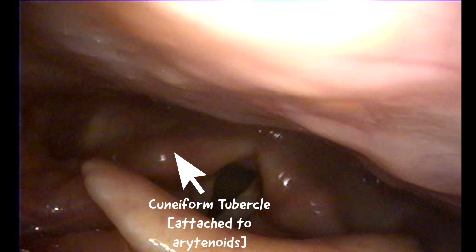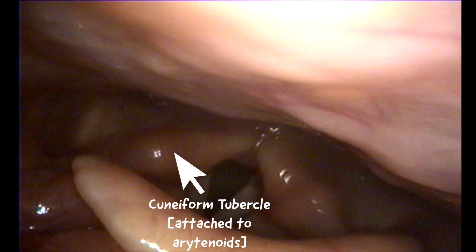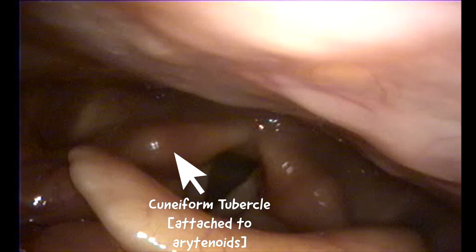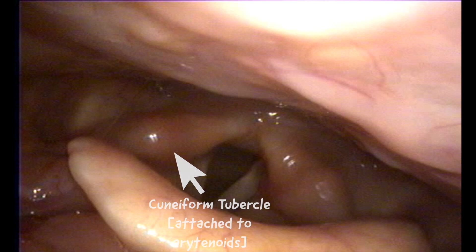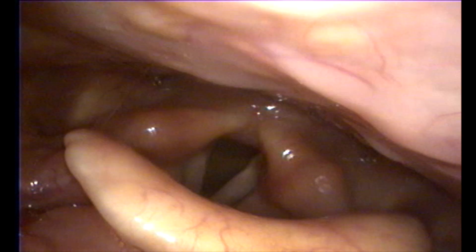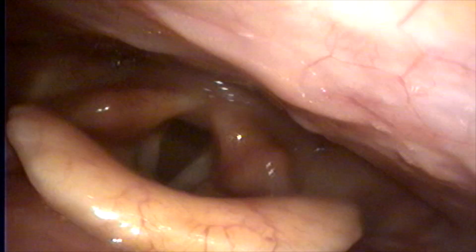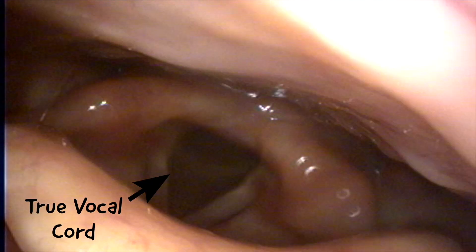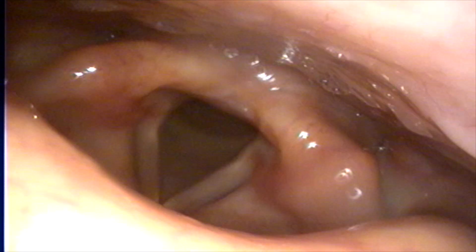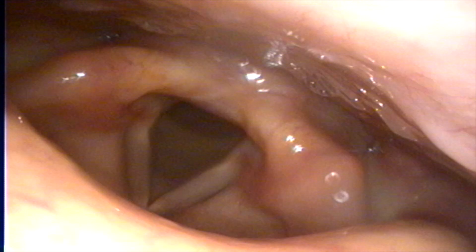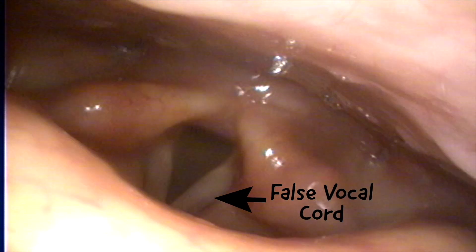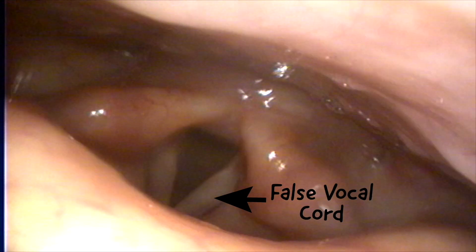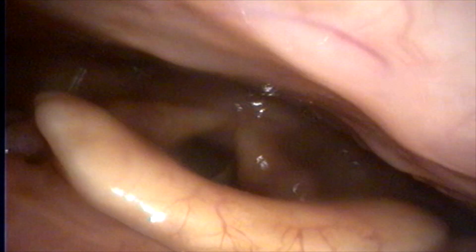I'll now point out some other important anatomical structures such as the cuneiform tubercles. These are paired cartilages that attach to the arytenoids and support the vocal cords and lateral epiglottis. Let's also point out the true vocal cords, which can be seen here as the two V-shaped white bands that have just opened, and also the more lateral false vocal cords. We will look at these in more detail later on.